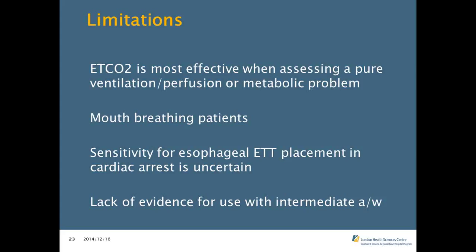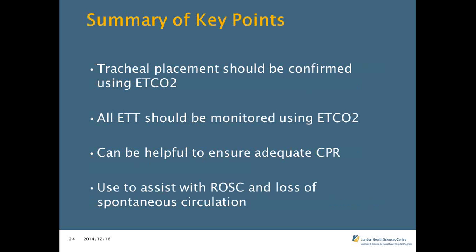So it should be used with intermediate airways such as the King LT. However, there is a lack of evidence, but it still should be used and should be able to produce an EndTidal CO2 capnogram and level for you.